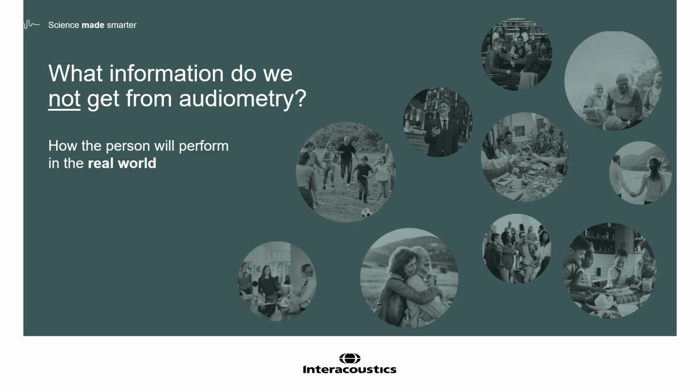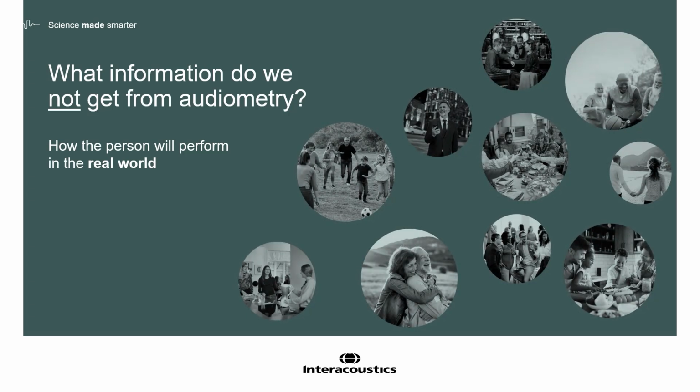The audiogram doesn't tell us how the patient will perform in the real world. The ability to hear pure tones in quiet does not reflect the typical demands that everyday conversational situations impose. And using only pure tone audiometry to fit hearing aids is limited in the guidance we then have for advanced hearing aid feature settings. Finally, as many studies have shown, we know already that pure tone audiometry is a poor predictor of intelligibility.